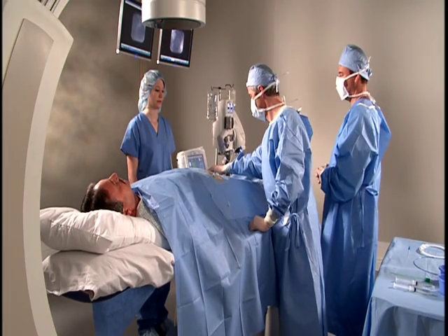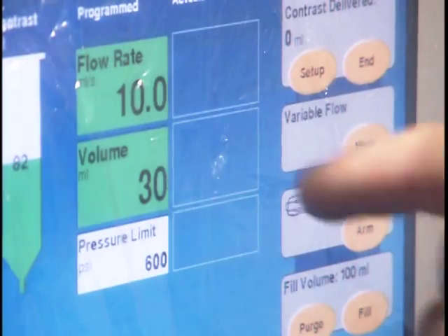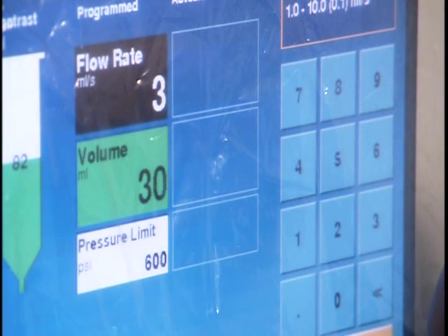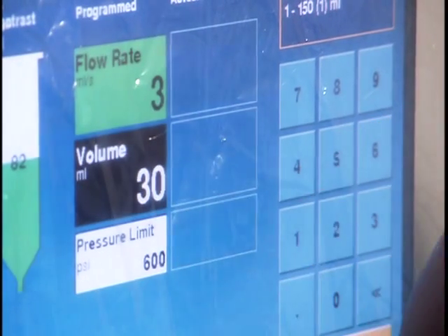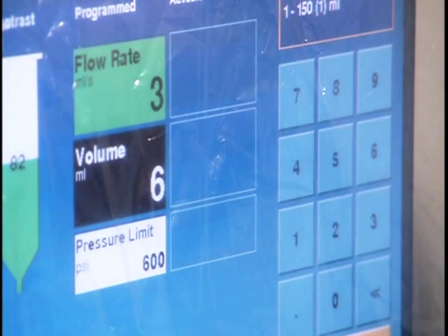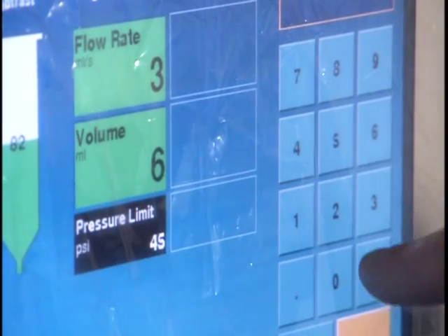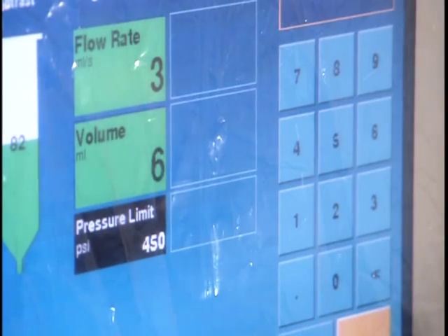To program a contrast flow rate in the variable mode, enter 1 to 10 milliliters per second in 0.1 milliliter increments on the touchscreen. Next, program a volume from 1 to 150 milliliters. Then program a pressure limit from 300 to 1200 psi based on the catheter rating.